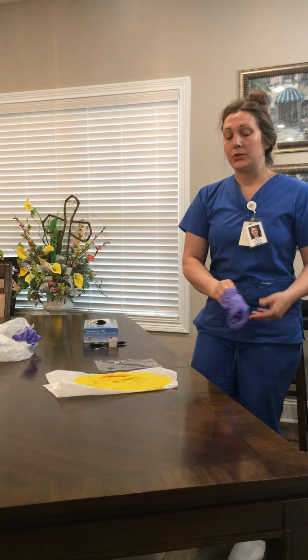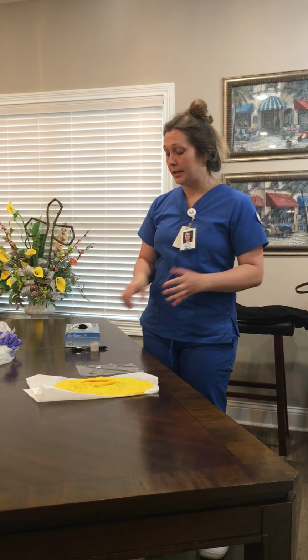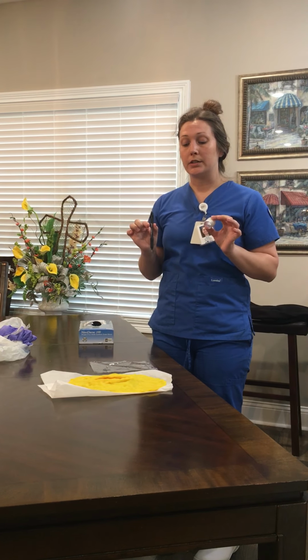So now we're ready to get our sterile field ready. But before you open your sterile field, you want to make sure that you have everything that you need prior to doing that. So first what I'm going to do is get tape and a pen, and you want to measure your wound to get 3 pieces of tape, and you also want to write your initial date and time on a little piece of tape. That way when you're done, you can put it on there.